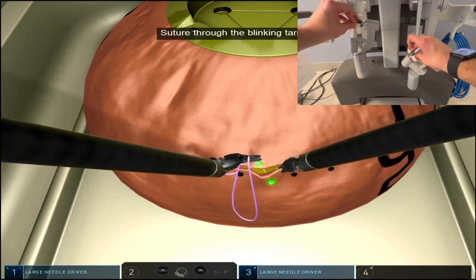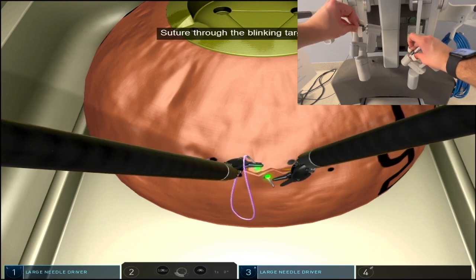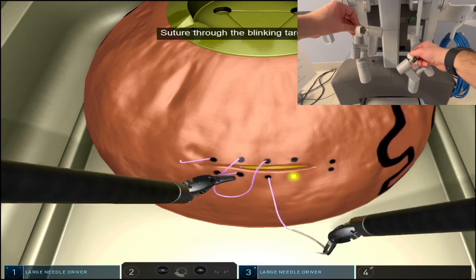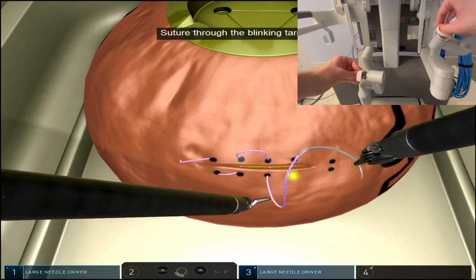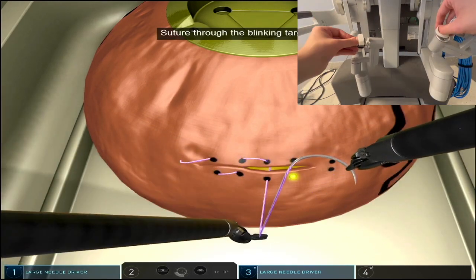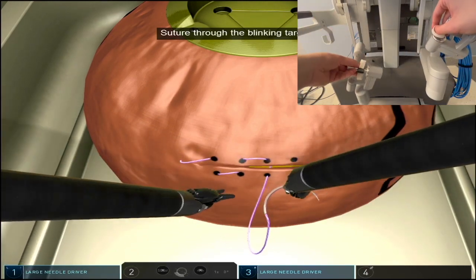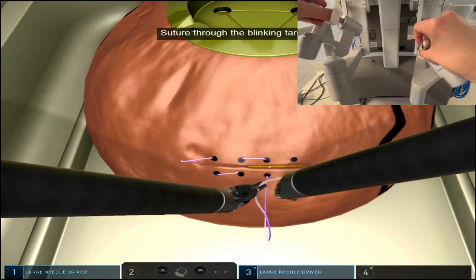You can either supinate or pronate your hand as you go. You can pull the excess suture line as shown here.